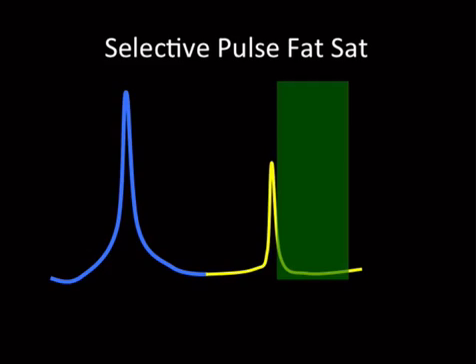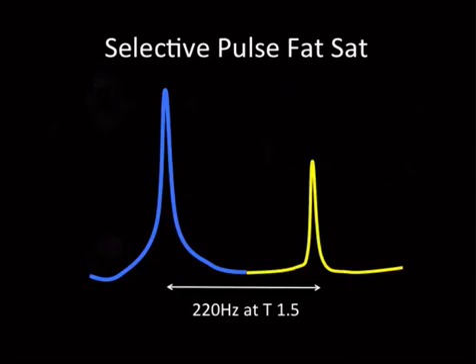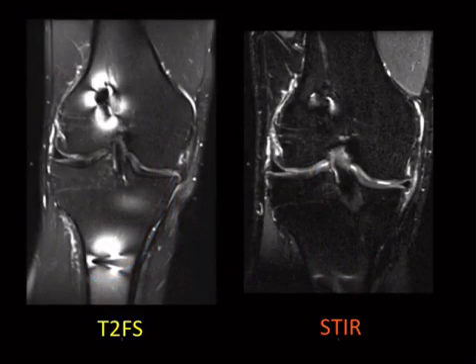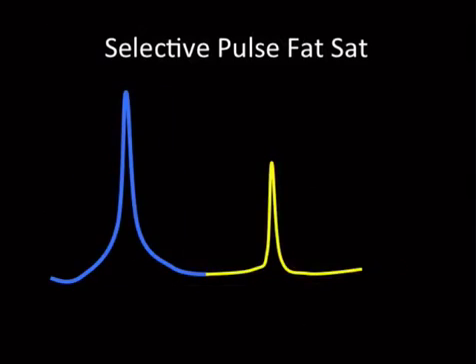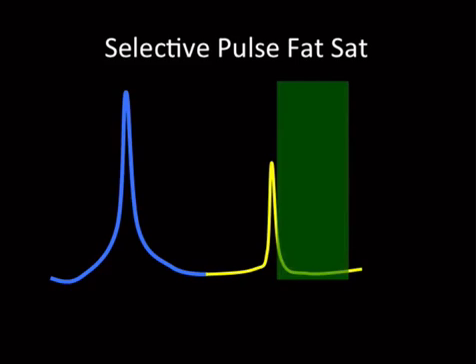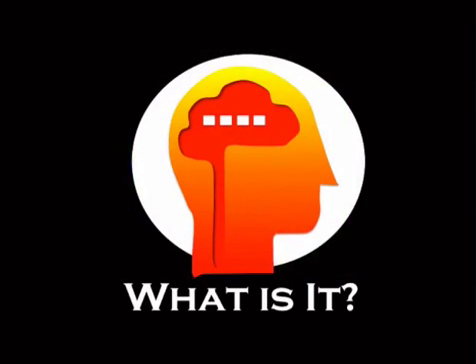Now you can get a little bit of mess up with STIR, but it's not nearly as bad. So if we go back and look at the case, there's a little bit right here, like this, but it's a pretty big difference. I mean, just a little bit of signal here, but it's a big difference. So STIR is much more durable with regard to dealing with metal and this inhomogeneous local field, relative to the conventional fat saturation tactics.